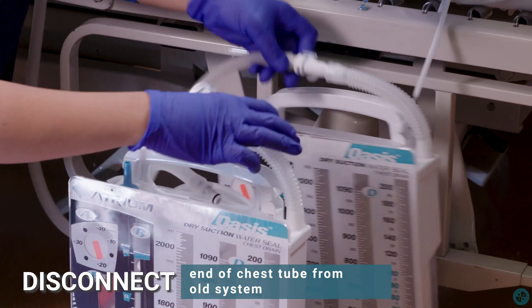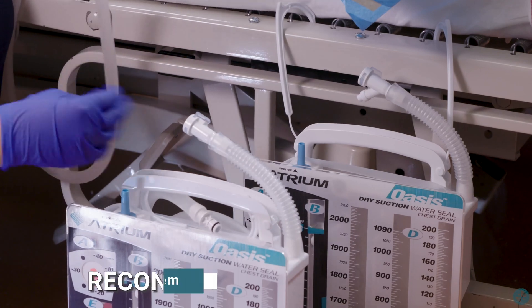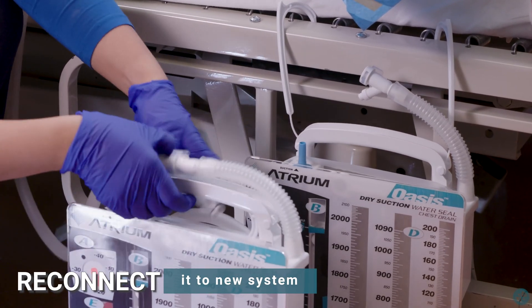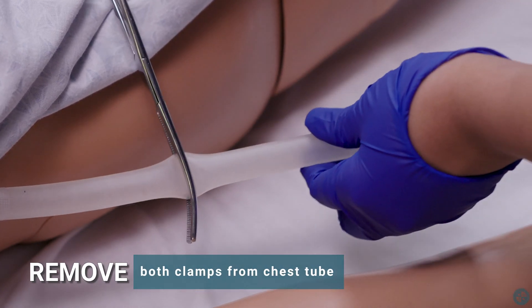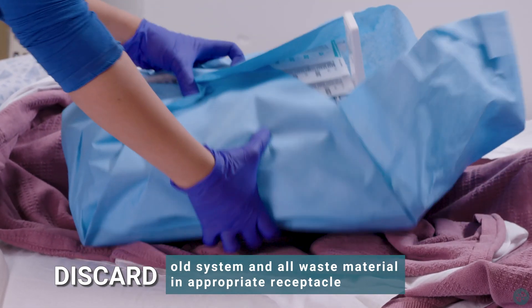Disconnect end of chest tube from old system. Reconnect it to new system. Remove clamps from chest tube. Discard old system and all waste material in appropriate receptacle.